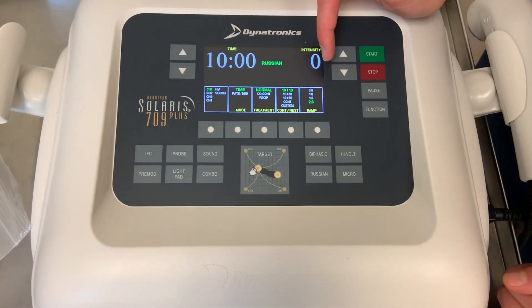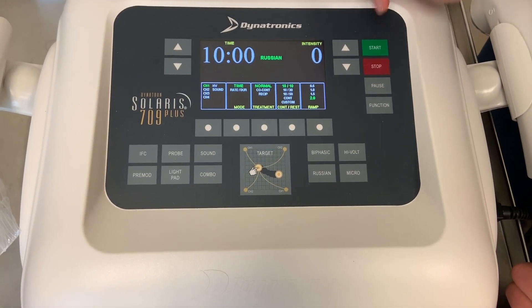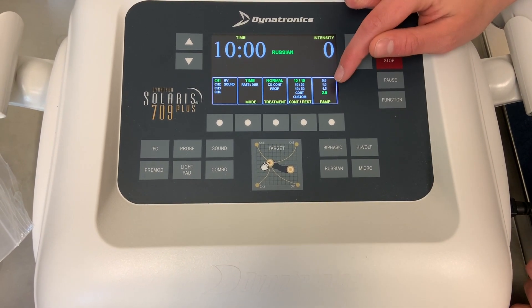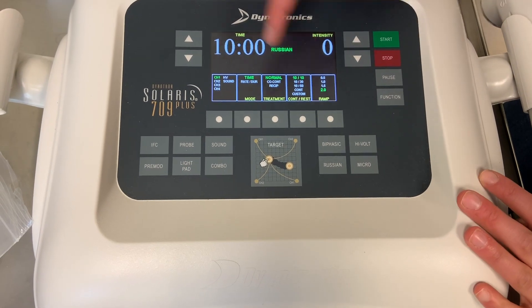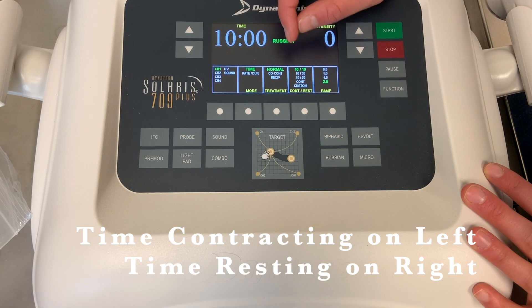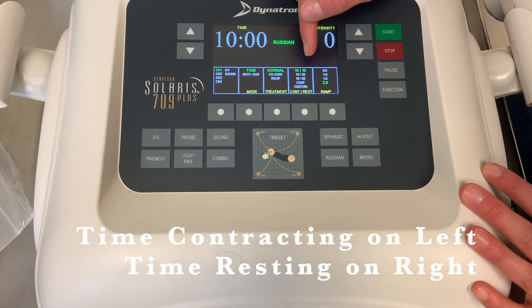These are the different settings on Russian. For regular Russian, you'll just leave them the same, but I'll explain them. This setting here is how quickly it ramps up to a contraction. This setting is how long it's resting versus contracting — so 10 seconds rest, 10 seconds contracting.